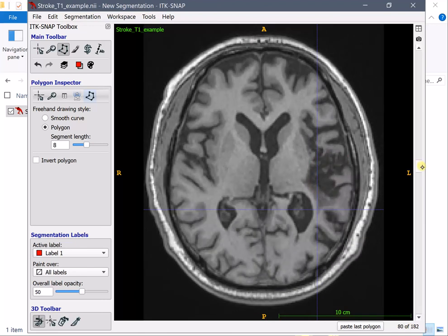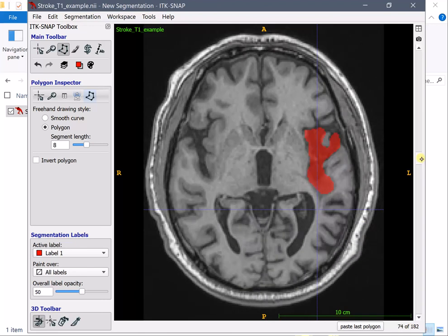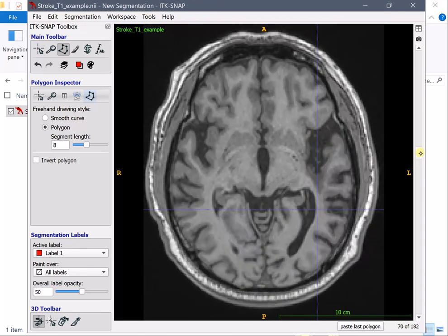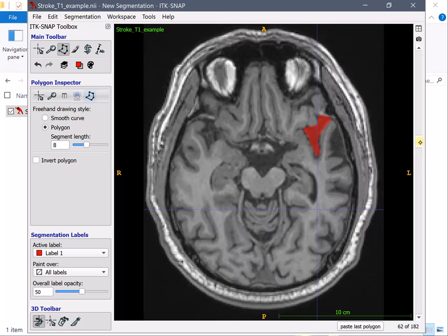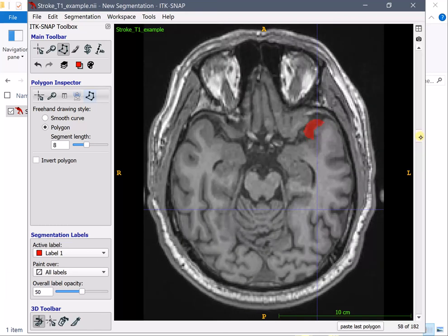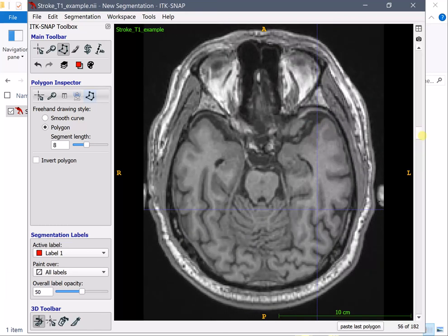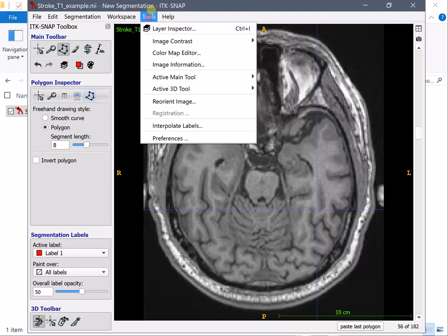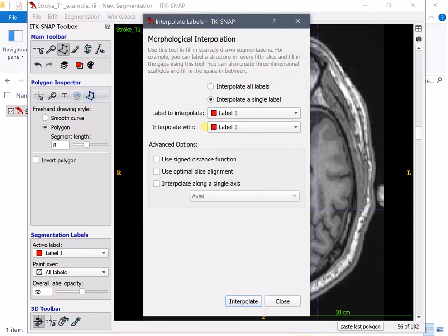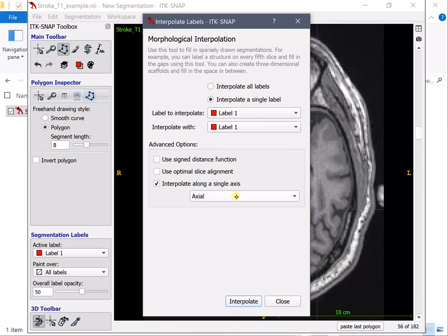So it's about five every five slices every six every seven you can follow a specific protocol with a very specific number of slices. So what we're going to do now is use the fast interpolation tool interpolate labels we'll interpolate label one with label one we'll interpolate on a single axis we'll interpolate on the axial.